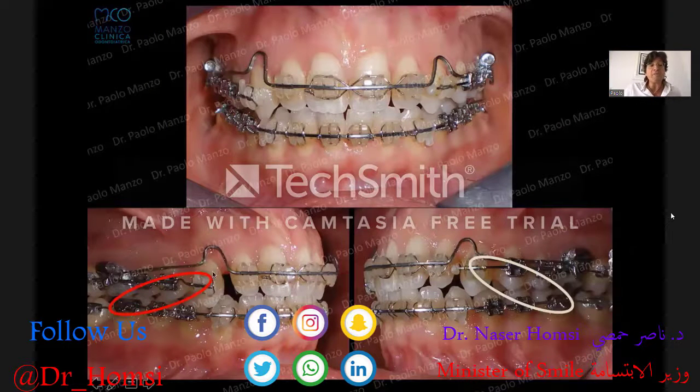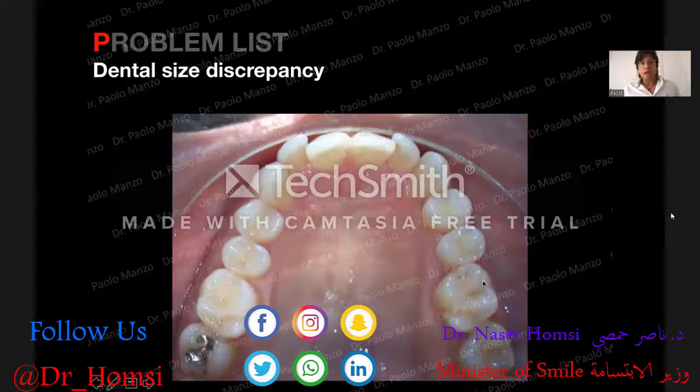And as you can see, we have class 1 on the left and on the right, and we are still keeping the class 1 on the left. But now we have to face this problem. I told you, we cannot correct the dental size discrepancy only by means of orthodontic treatment, but we need one more step. The step can be a direct restoration step, or an indirect restoration step.